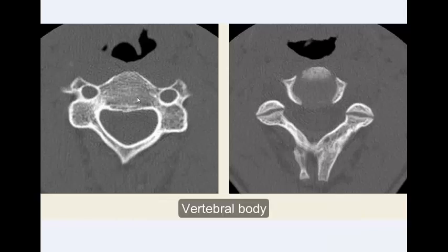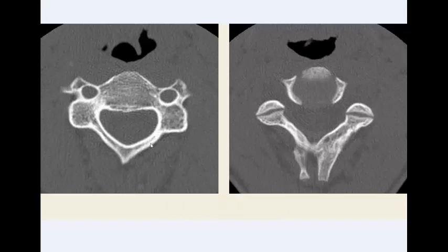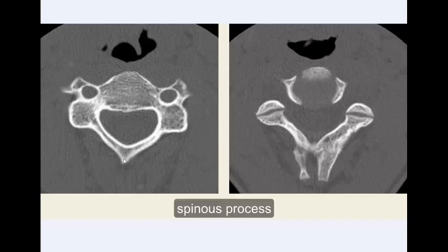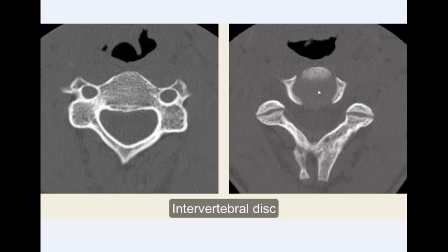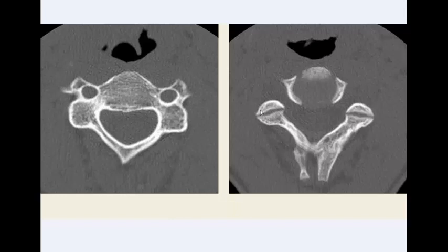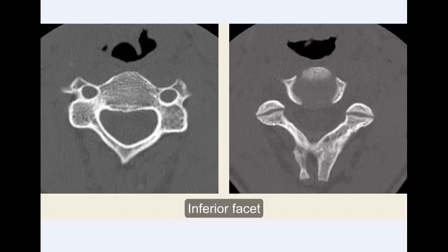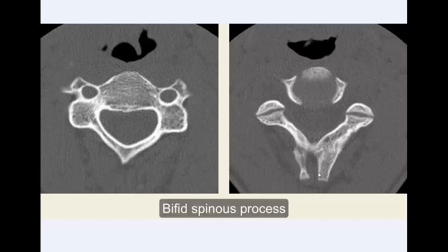Structures visible include: the vertebral body, transverse foramen, transverse process, lamina, spinous process, intervertebral discs, uncinate process, superior facet, inferior facet, facet joint, and spinous process.